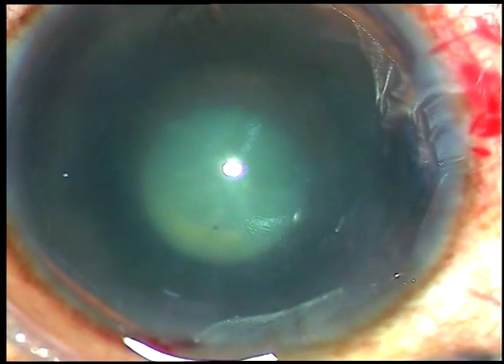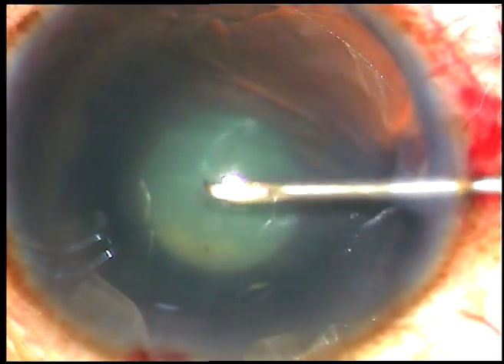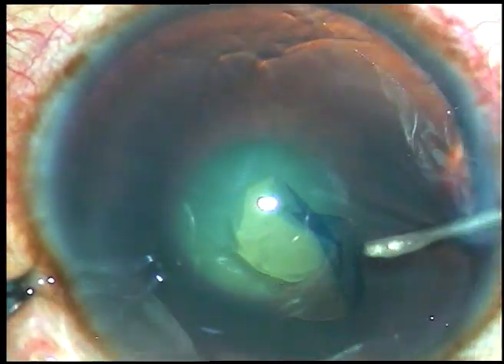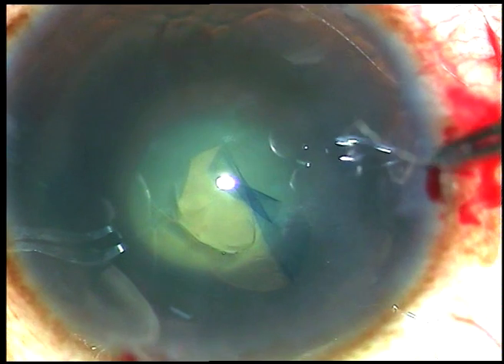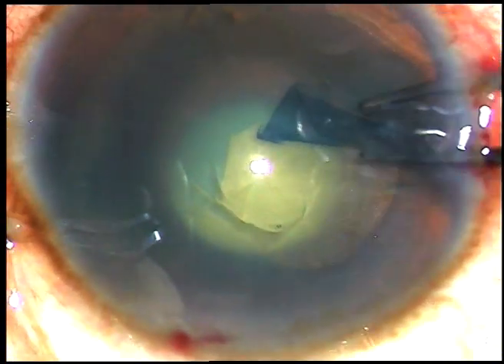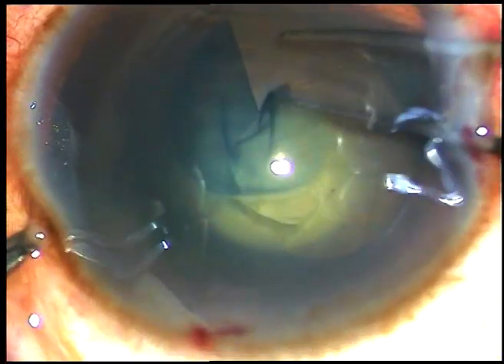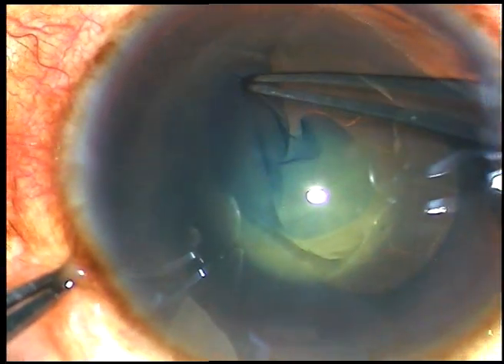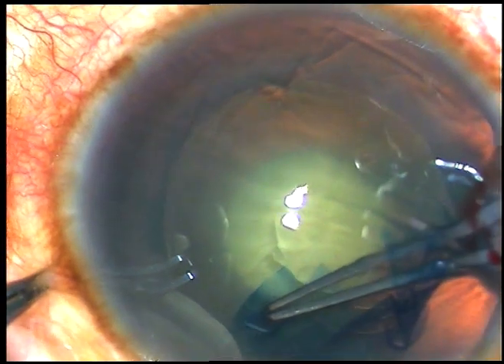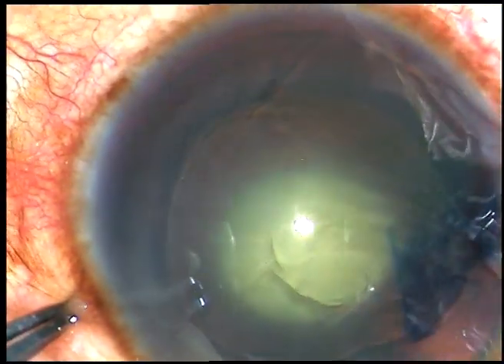Viscoelastic substance has been injected into the anterior chamber. Now capsulorhexis — the anterior capsule is incised, the flap is raised, and I hold this flap with Utata forceps. My natural movement is to go anti-clockwise; if you are comfortable with clockwise movement, please continue that. So with anti-clockwise movement, CCC is done.